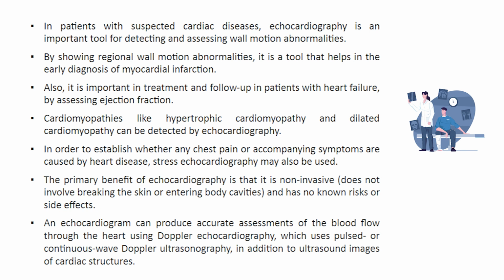The primary benefit of echocardiography is that it is non-invasive, means it does not involve breaking the skin or entering body cavities and has no known risk or side effects.